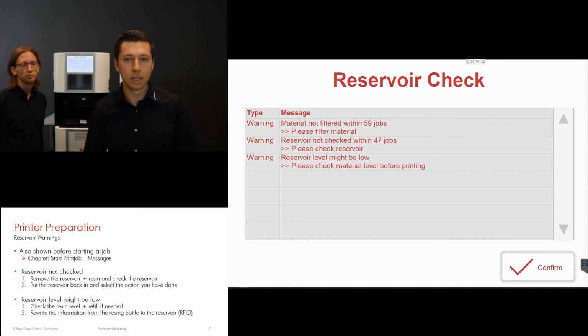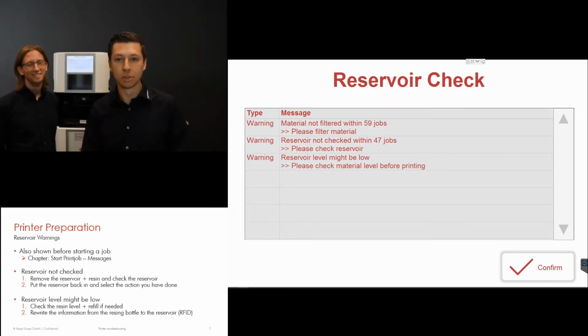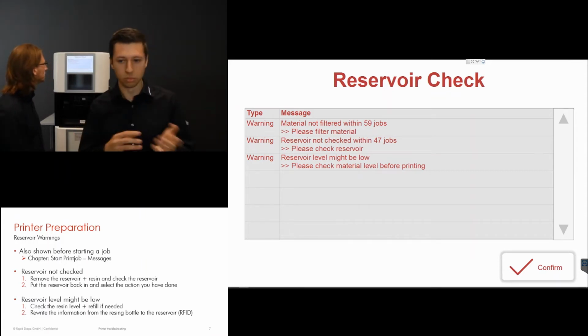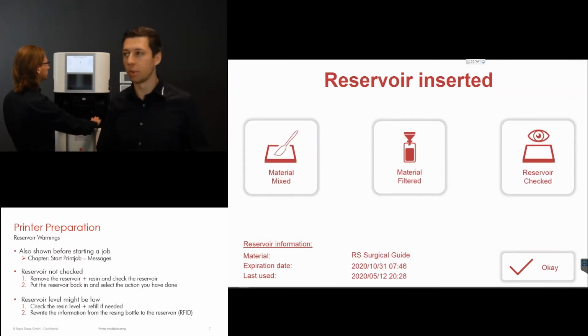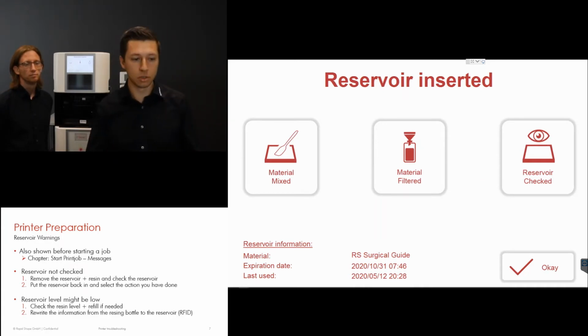We can see on the printer the reservoir was not checked for 47 jobs and the material was not filtered within 59 jobs. So this is kind of a bad condition of the reservoir already and the material, I assume. Pretty much. And the reservoir level might be low. Let's start first with reservoir not checked. Easy solution. You remove the reservoir, you remove the resin, best is to filter it also, and you check the reservoir by holding it in light somehow.